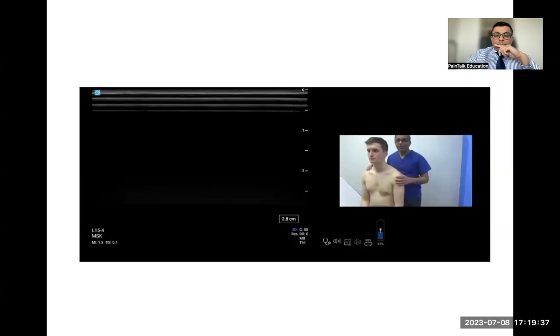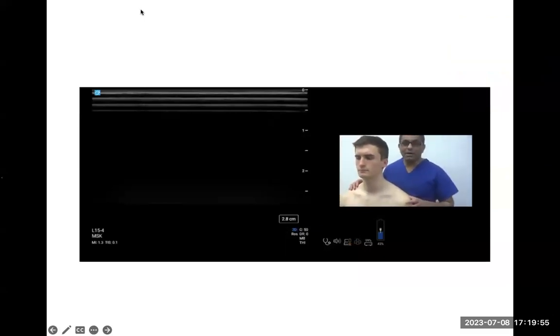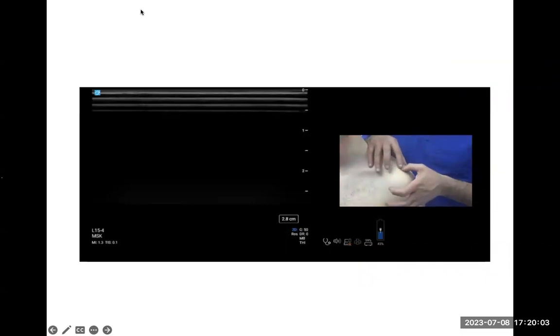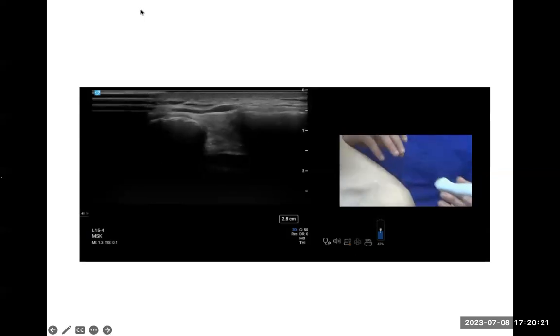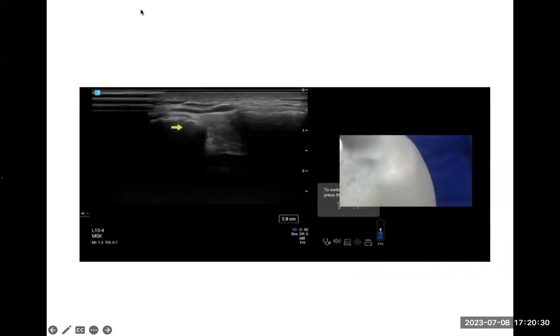The second step is to feel for the clavicle and then the acromion — their junction is the acromioclavicular joint. Place the probe on top of the joint and you'll see the acromioclavicular joint highlighted. The clavicular end and acromial end are visible along with the joint capsule, supraspinatus muscle, and bursa on top — the subacromial bursa.